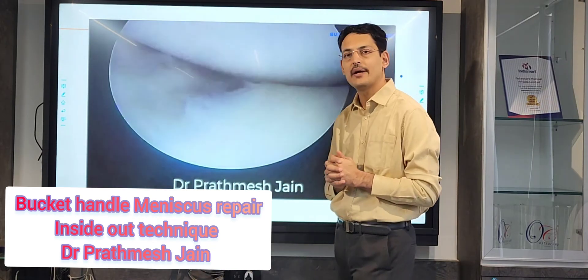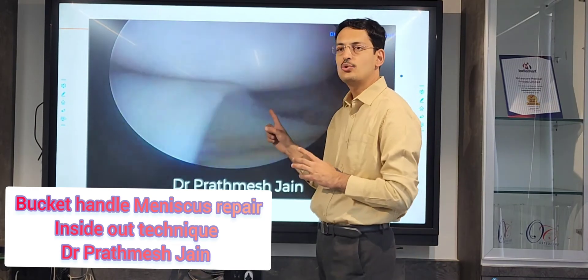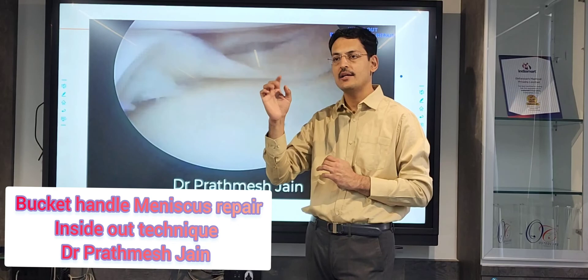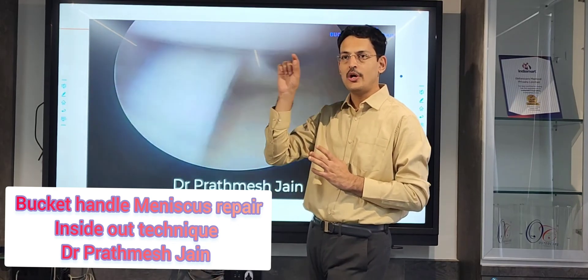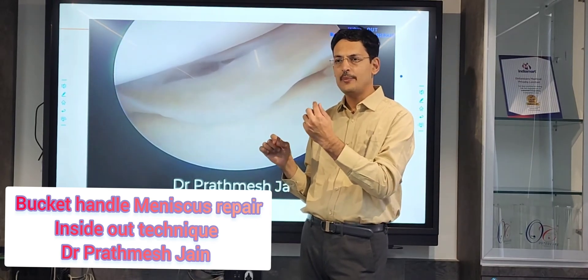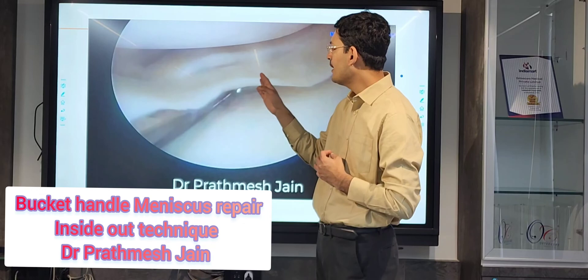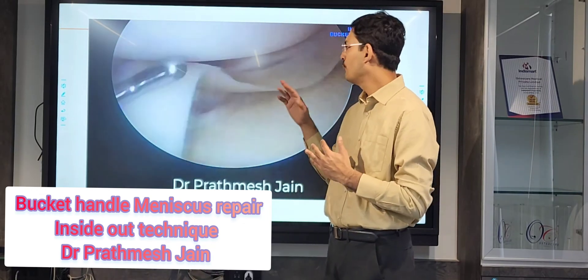This is called a double bucket handle configuration. The most important thing here is to do a very good piecrusting. The piecrusting is done at the magic point, which is approximately on the femoral side at the posterior junction — where you join the line between the femoral and tibial epicondyles, just posterior and toward the femoral side.